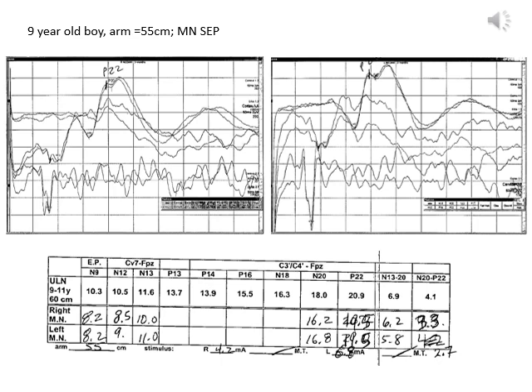And when we look at the numbers, we check first that we have an appropriate age and arm length table, which it is. And then we check that motor threshold was attained, which it was, as we can see in the bottom right. There, the MT lines are checked off. And then we just scan the numbers, and we see that all of the numbers are below the upper limits of normal for all the absolute latencies as well as the interpeak latencies. And so therefore, this is a normal upper limb SEP study bilaterally.